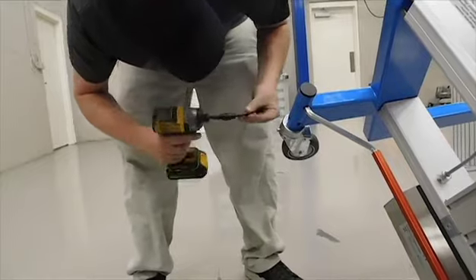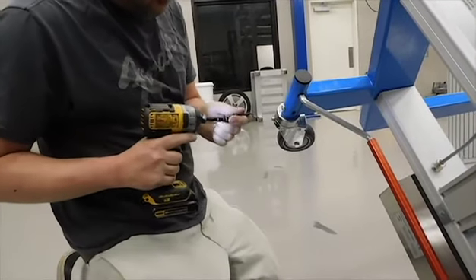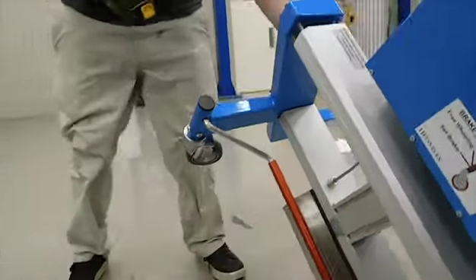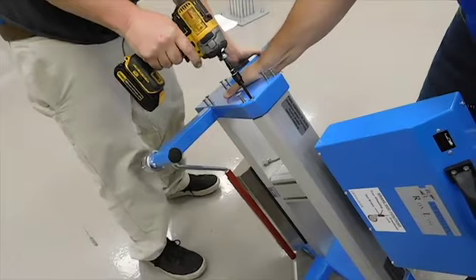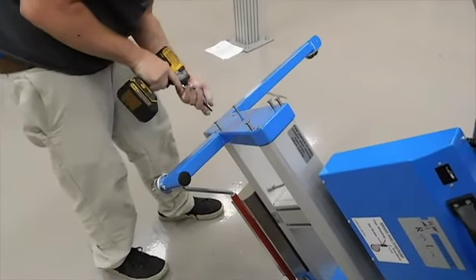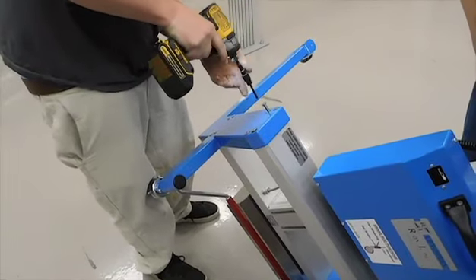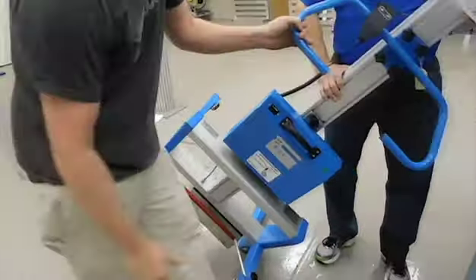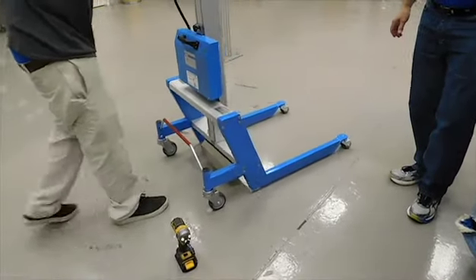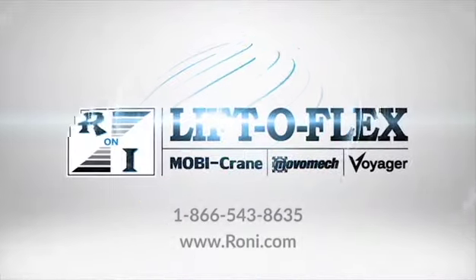Make sure it seats in really well. Get the bolts back in and you're done.